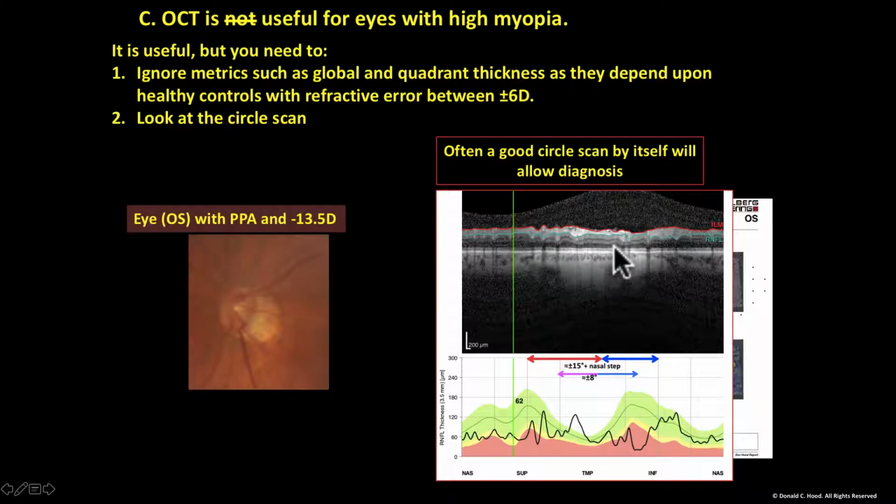So let's blow this up. And what do you see here? Well, this peripapillary atrophy is showing up as this bright spot here, but you can still see this. In fact, you can actually see you've got some epiretinal membrane there. This big defect here is right here, and you can see that's real, the tissues, and you can see thinning here as well, and that's going to be smack in the macula.